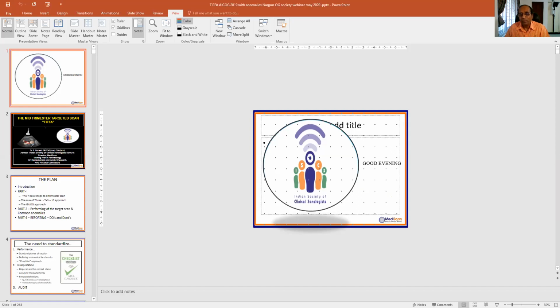All you need to see in a patient is whether there's good penetration. If you take the image of the heart, look at how many internal echoes and other noise come in the image, and whether the frame rate of the machine is very good. When the heart is beating, you should not see it beating very slowly. So once you have a good frame rate and good contrast, that should do. In fact, there are very few bad machines in the market, and those are very low-end, very portable ones, which you can use only in the labor ward for looking at fetal heart and placental position. But most of your machines will do your job.